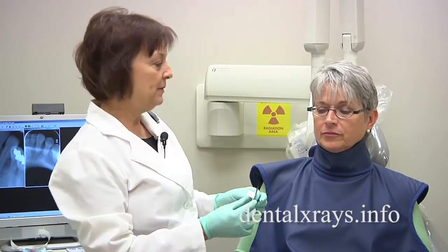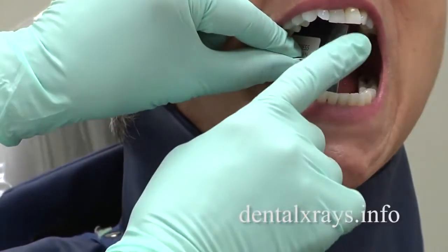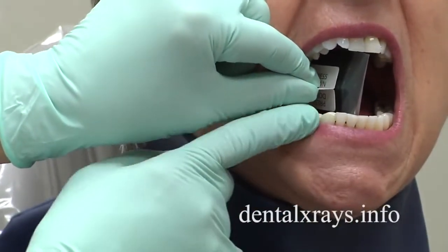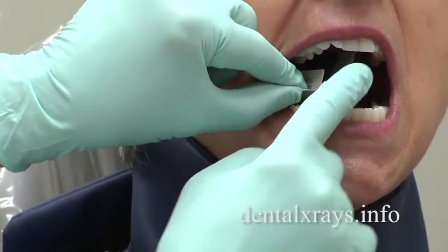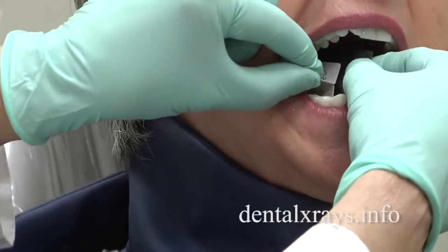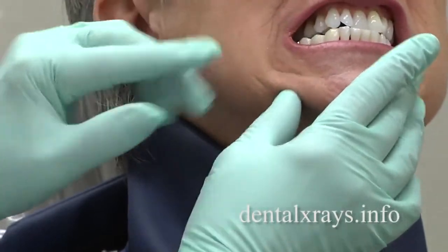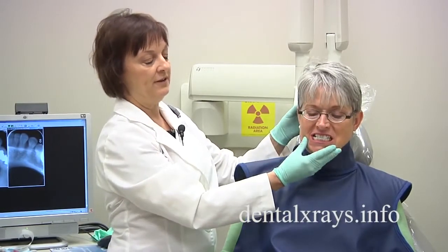The other part of bisecting angle is your bitewings. If you use a bitewing tab, you're going to place the film to include the premolar. So you want to make sure your film is far enough forward in the mouth, right behind those front teeth, so that you're including the space between the canine and the first premolar. If it's sitting way back and the tooth is in front of the film, you'll need to wedge it slightly to the side. For bisecting angle, you don't want them sitting with the occlusal surface tilted, so just bring the chin down and now you're only working with the angles you need with the tube.